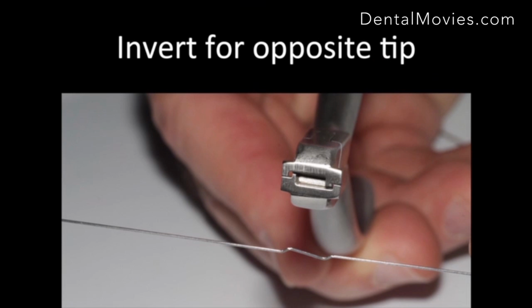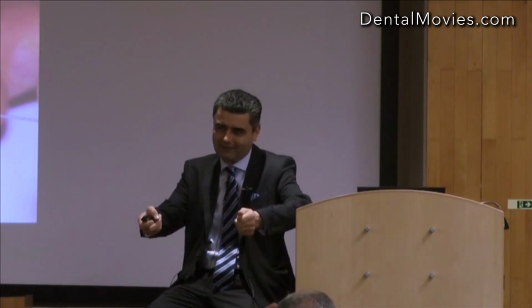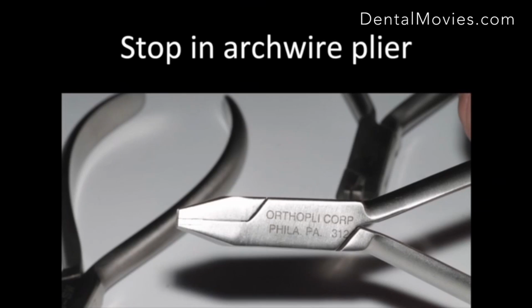If I want to tip the other way, you don't need a special plier. I'd love to sell you one, right? So would the rep. Probably sell you two. So use that for the right, use that for the left. Get the plier, turn it the other way, press. Everyone happy? This plier you don't need, but I'm just going through pliers, right?